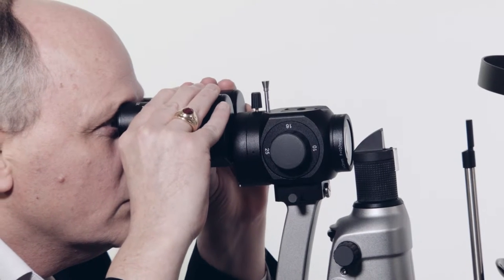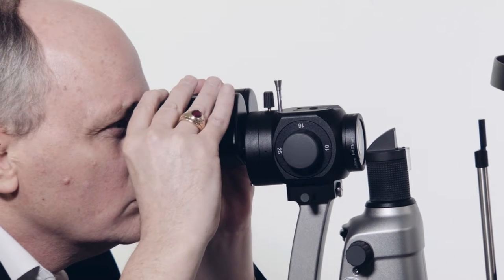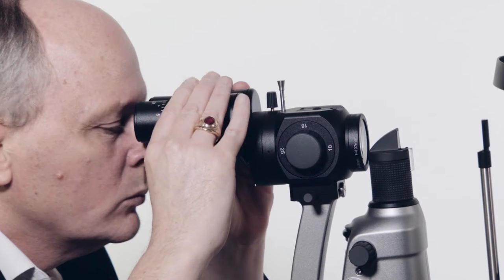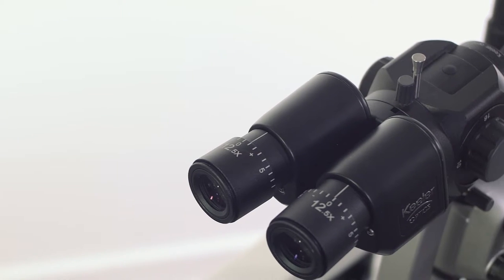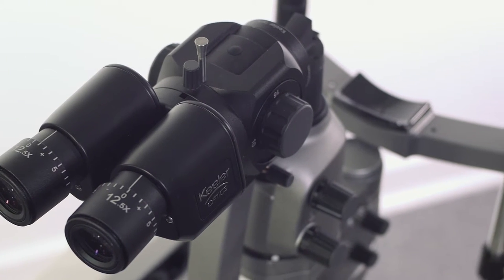Before using the slit lamp for examination, adjust the eyepiece's pupillary distance. The PD ranges from 49mm to 77mm on the 8-degree converging eyepiece and 38-85mm on the 0-degree parallel eyepiece.